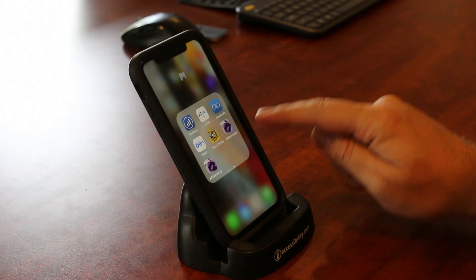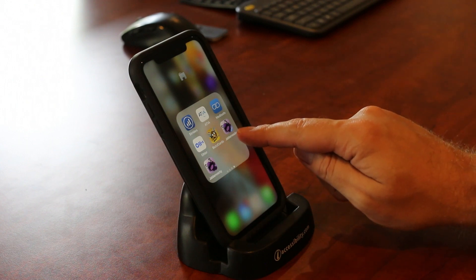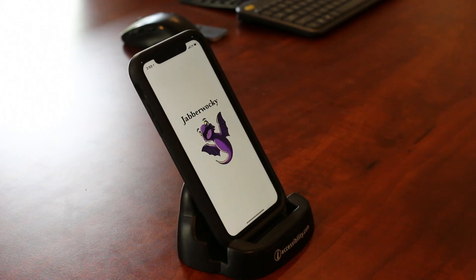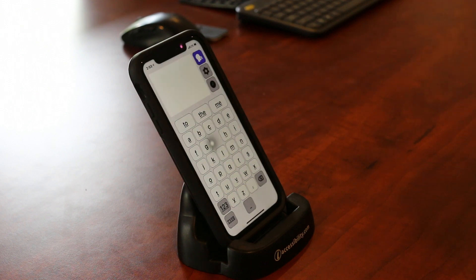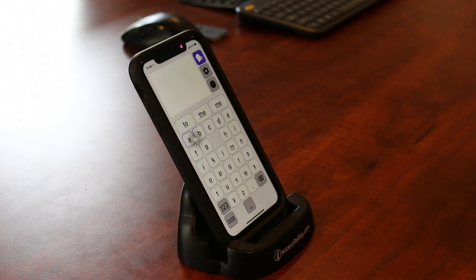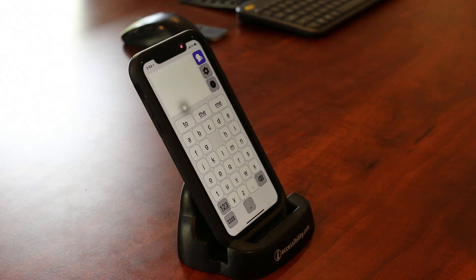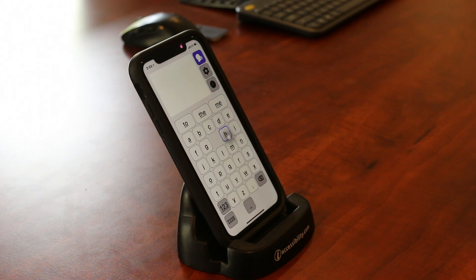All right, so first all I have to do is open the Jabberwocky AAC app. You'll see that it tells me to look here, and now you'll notice this little lit up part in the middle of the screen going around to the different letters, and I'm just moving that by moving my head. It actually calibrated just by looking at the middle of the screen for a few seconds. So now I can sit here and type something in, and all I'm doing is blinking to select the letters.